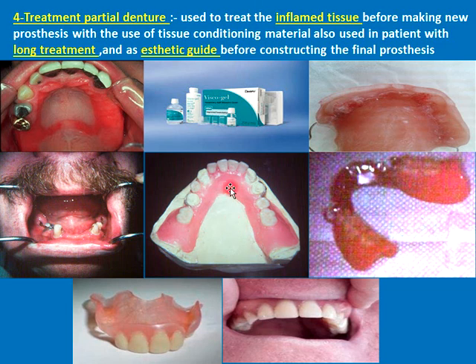إذن والother use هو as an aesthetic guide. يعني for example إذا patient losing his anterior teeth we want to make an idea، نريد نسوي فكرة عن نهاية العلاج اللي ممكن تصير، فنسوي هذا partial denture in order to make an idea about how the final prosthesis is going to look، شلون راح يكون شكل الفاينل prosthesis. فنصنع هذا partial denture ونسوي فكرة على end result whether we keep it as a partial أو نسوي implant أو نسوي bridge. إذا يعتبر نوع من أنواع treatment partial denture.